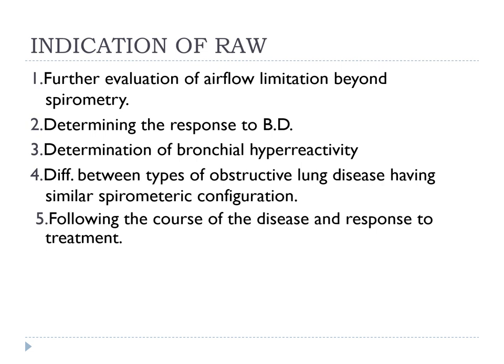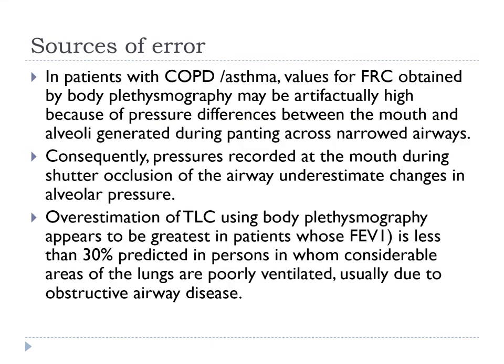What are the indications for airway resistance? It helps in the evaluation of airflow limitation beyond spirometry. It helps in the determination of the response to bronchodilators, which we give as medication: is it improving the patient or not? It helps in the determination of bronchial hyperactivity, differentiating between types of obstructive lung diseases having similar spirometric configuration, and following the course of the disease and response to treatment.